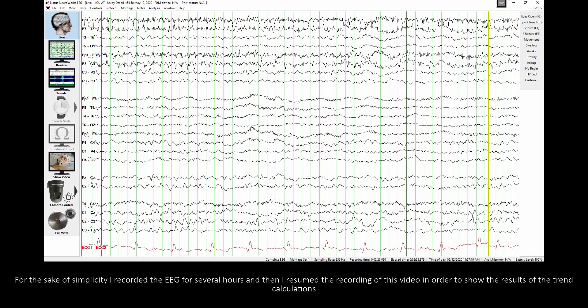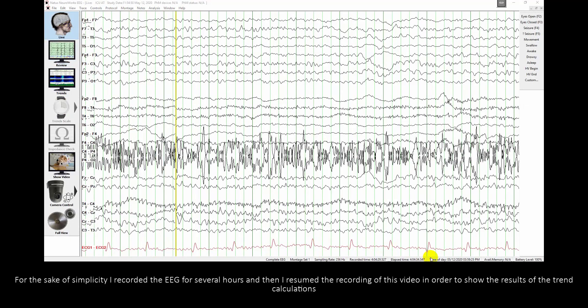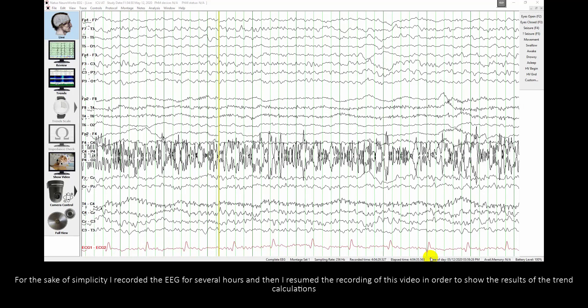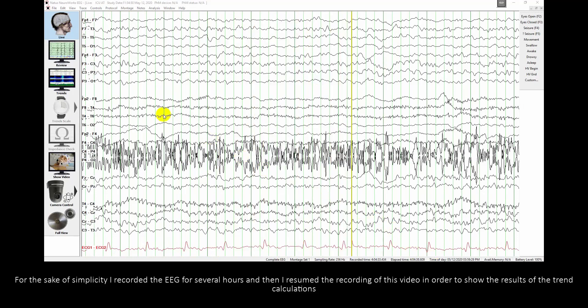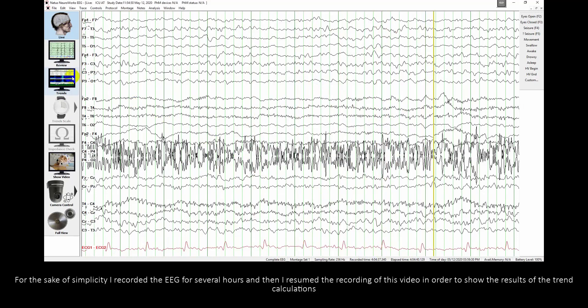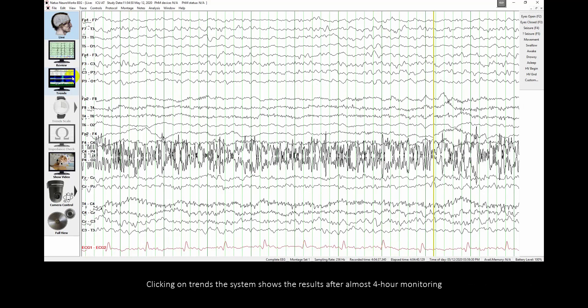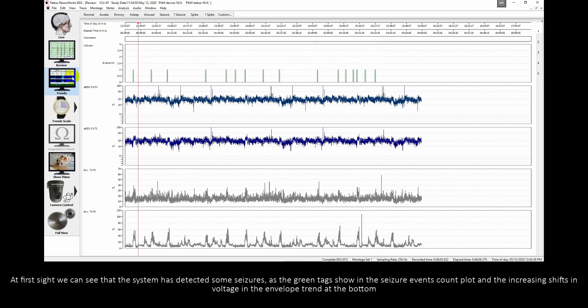For the sake of simplicity, I recorded EEG for several hours and then resumed the recording of this video in order to show the results of the trend calculations. Clicking on Trends, the system shows the results after almost 4 hour monitoring. At first sight, we can see that the system has detected some seizures, as the green tags show in the seizure events count plot and the increasing shifts in voltage in the envelope trend at the bottom.